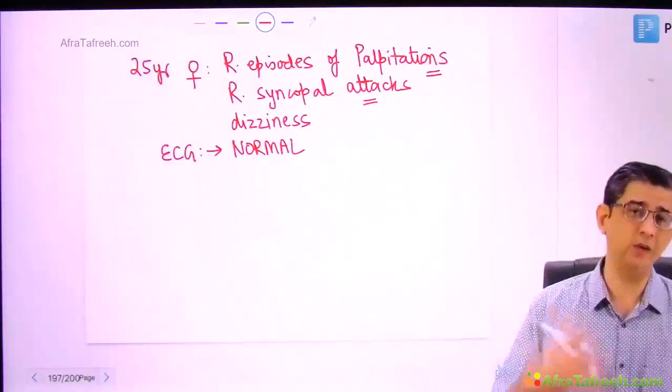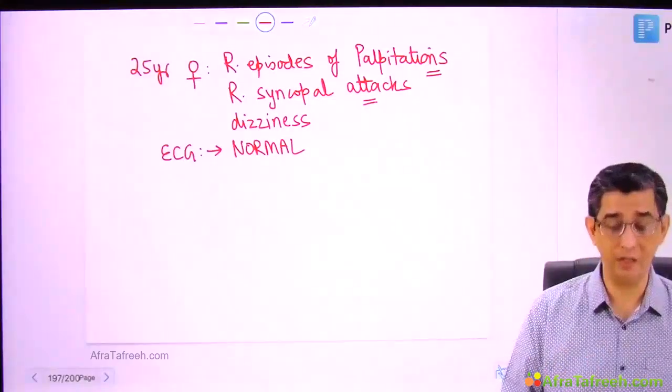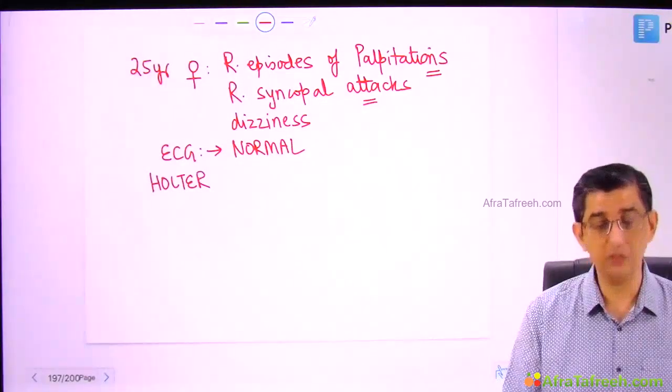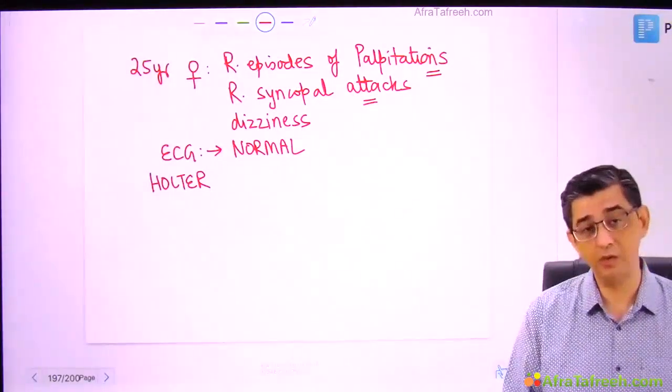Well, I cannot explain to her the concept of evidence-based medicine since she's a non-medico, but I want you to understand that I have demonstrated at the moment ECG is perfectly normal. But I'll tell her, ma'am, now with your permission, we will be putting a device on your chest which is going to record your ECG for the next 24 hours continuously.